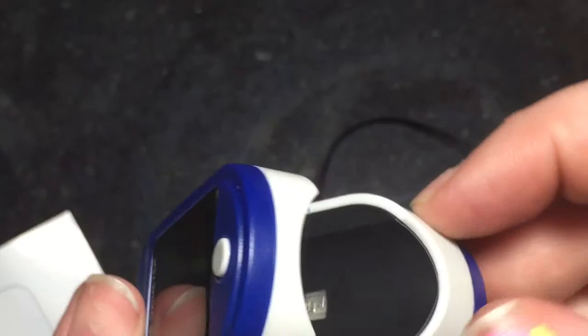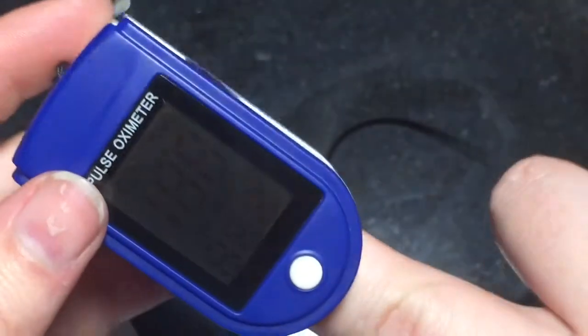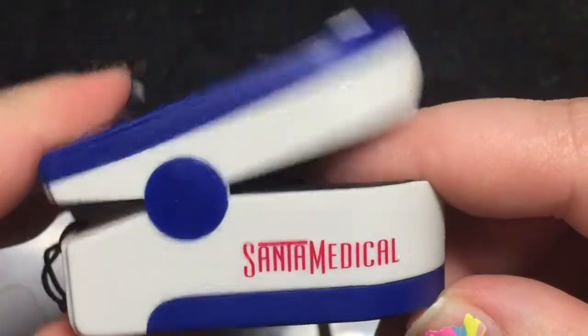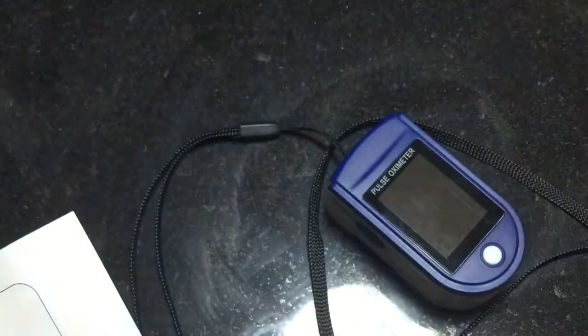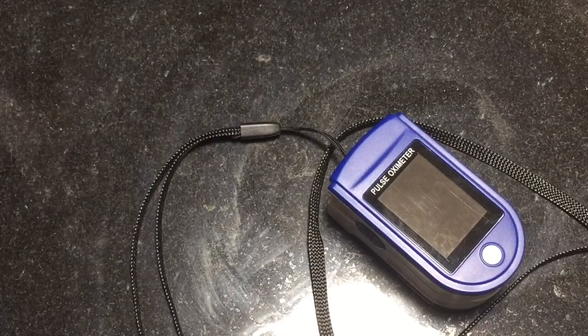I'm not exactly sure what caused the battery to go dead when it wasn't being used, but it has this nice soft cushion — it feels like it's made out of rubber — so it does not hurt whenever you're wearing it. It's really easy to operate and read, and it does shut down after 16 seconds if no signal is detected, like a finger inside of it.